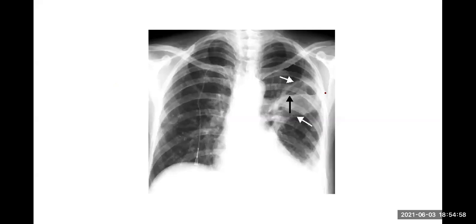Here you can see now another X-ray, a nodule. It looks like a nodule, but there is a fluid level. Right? It's not strictly a nodule, but you can call it a cavity actually with a fluid level. Now, earlier we saw a solid one. Now here there is a fluid level. What is this? This is a lung abscess.